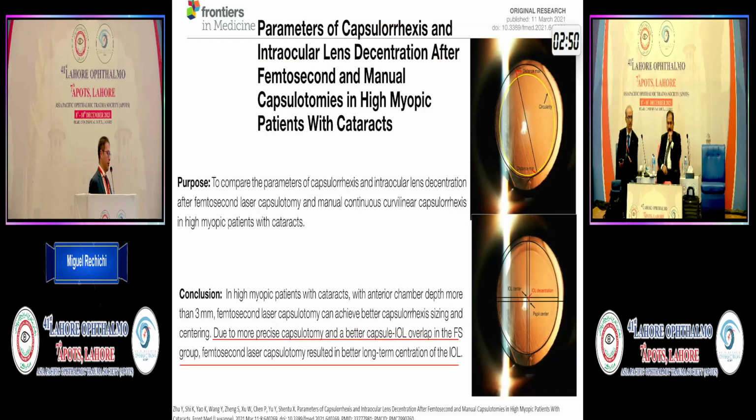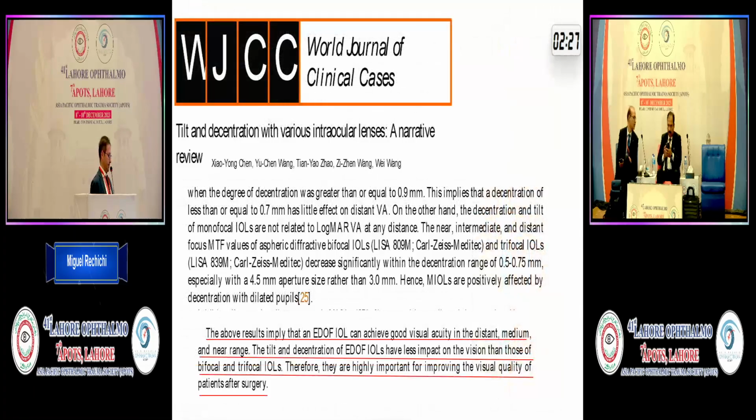But if you look at very abnormal eyes, like myopic eyes, we will see that the more precise capsulotomy we can reach with the femtosecond laser results in a better IOL overlap and less chance of phimosis.